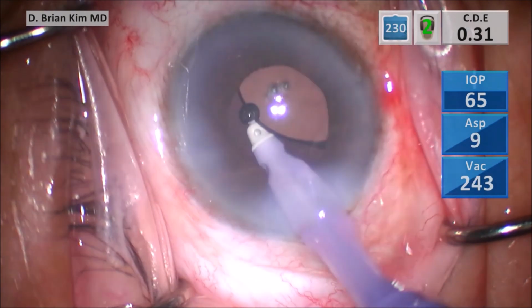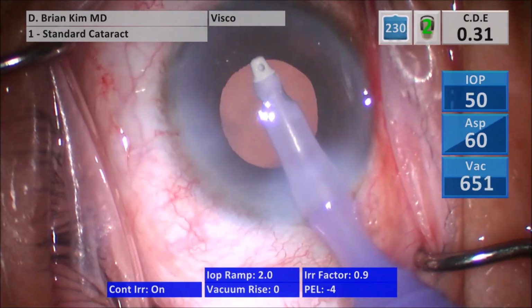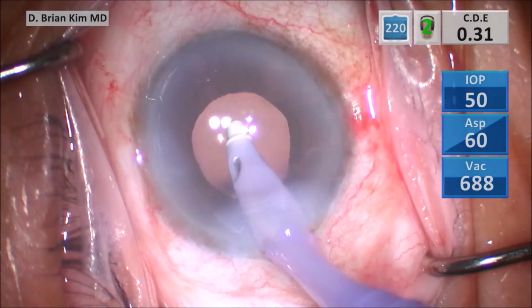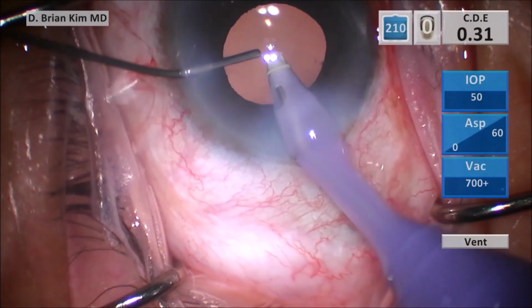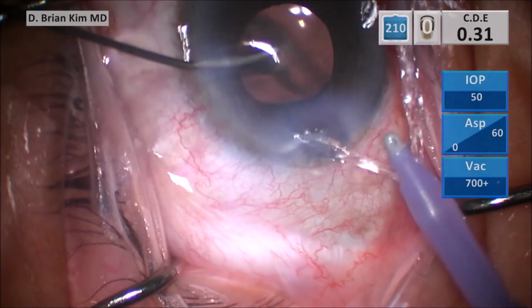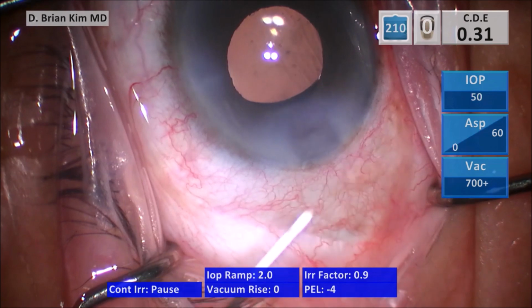I go underneath the lens to remove any viscoelastic from within the bag, and then I remove the viscoelastic from the anterior chamber. I'm pushing BSS in order to pulse into the angle in order to make sure that there's no viscoelastic. And then I remove the I/A handpiece, pushing BSS to stabilize the anterior chamber, and then I hydrate my incision.